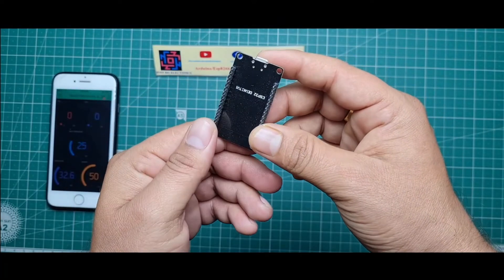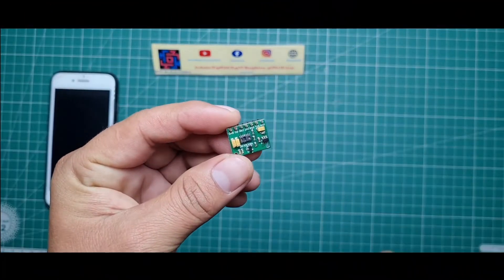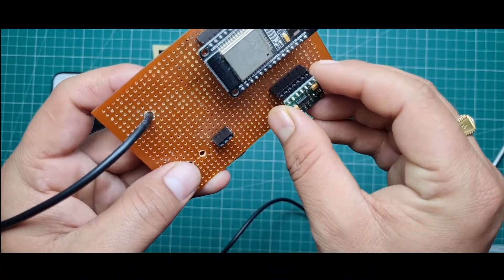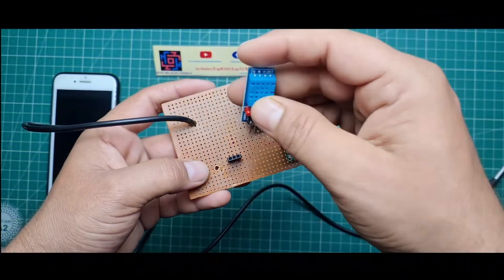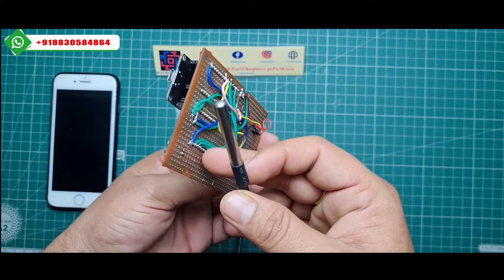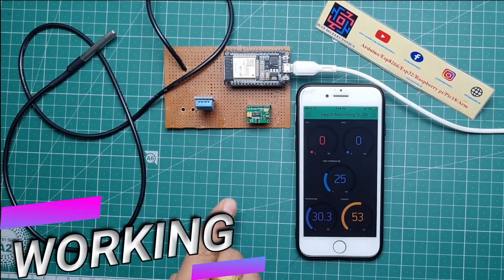For the hardware, I use a zero PCB and placed all the components on it. The ESP32 module is placed on a female header, and the MAX30100 heartbeat sensor is also placed on a female header on the zero PCB. I placed a female header for the DHT11 sensor and directly soldered the waterproof DS18B20 sensor with the 4.7 kilo-ohm resistor.